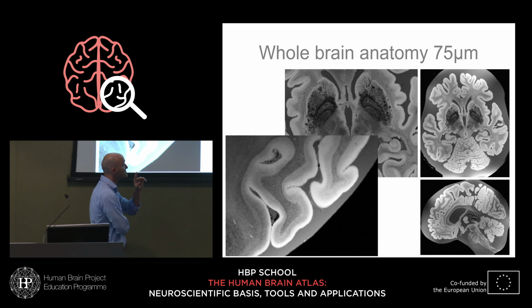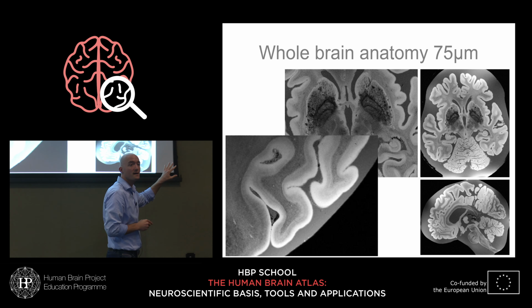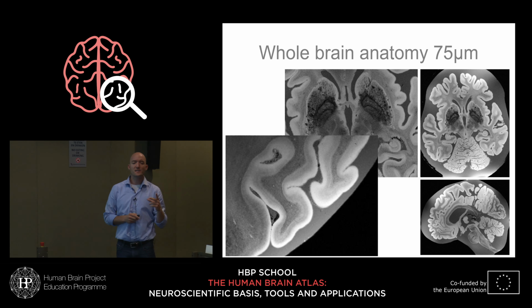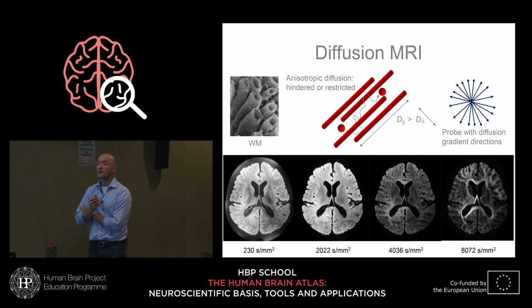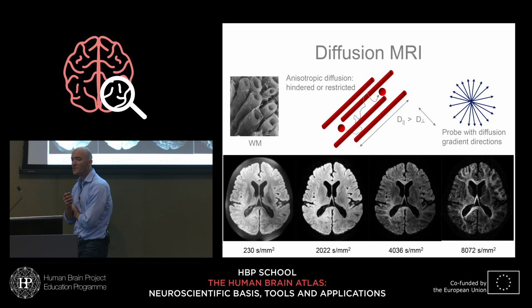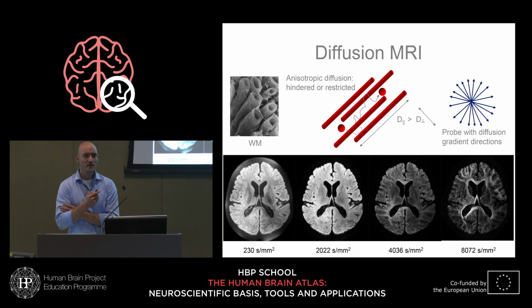Because of course, although this says a lot about myeloarchitecture and something about intracortical circuits, it is very indirect, right? It still doesn't have a shot at looking at connect architecture, and it still doesn't talk directly about connections. And of course, the technique in MRI to look at connections with is diffusion MRI. And I imagine that Svenja may have told you something about diffusion MRI.